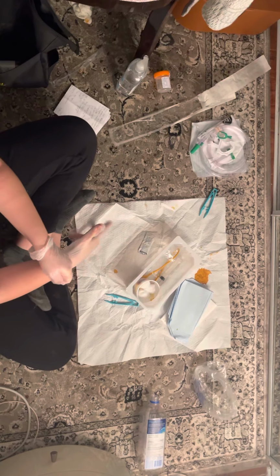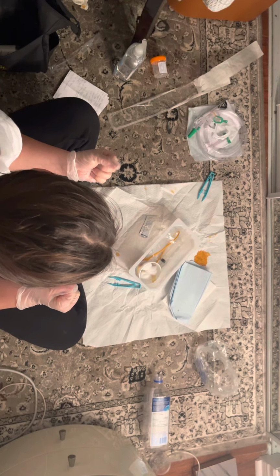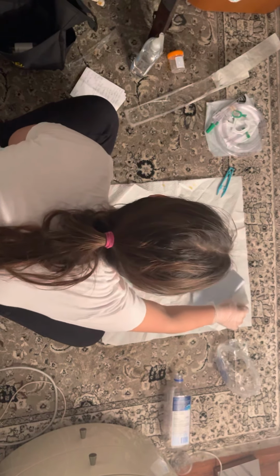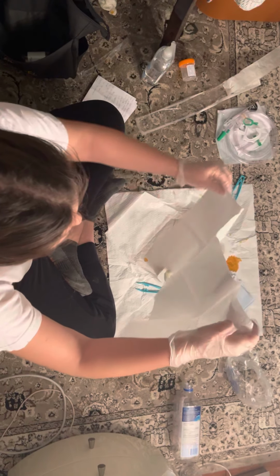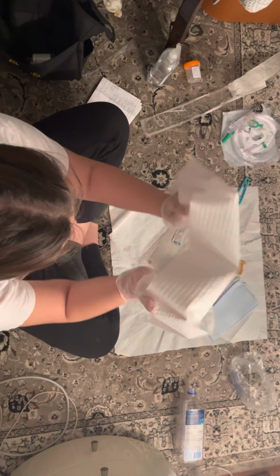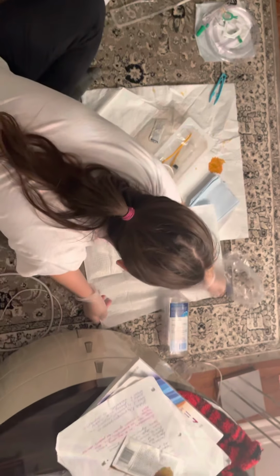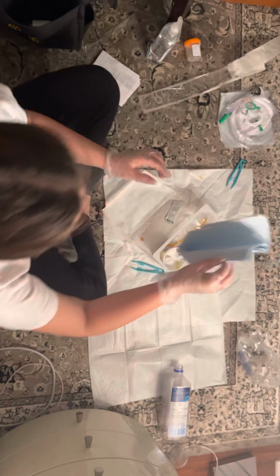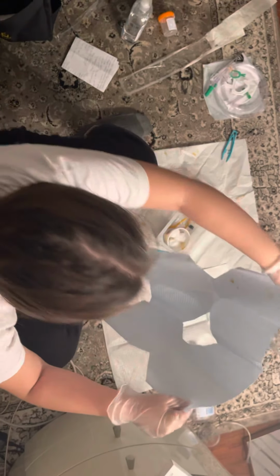So once I've put on my sterile gloves, I'm going to begin by placing the drape under my patient's thighs. And I can touch the drape because my gloves are sterile. So I'm going to do it like this, placing it under the thighs, ensuring that I'm only touching my 1-inch border. Next, I'm going to take my blue drape and place it over the perineum area, like this.